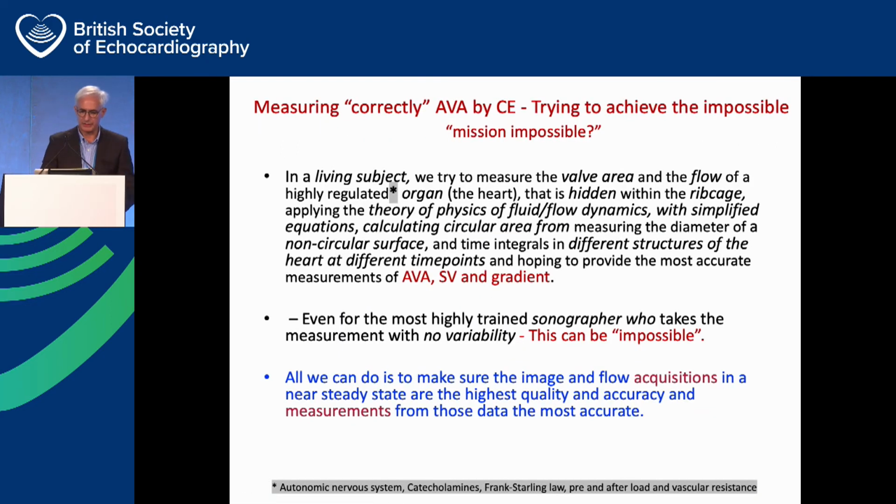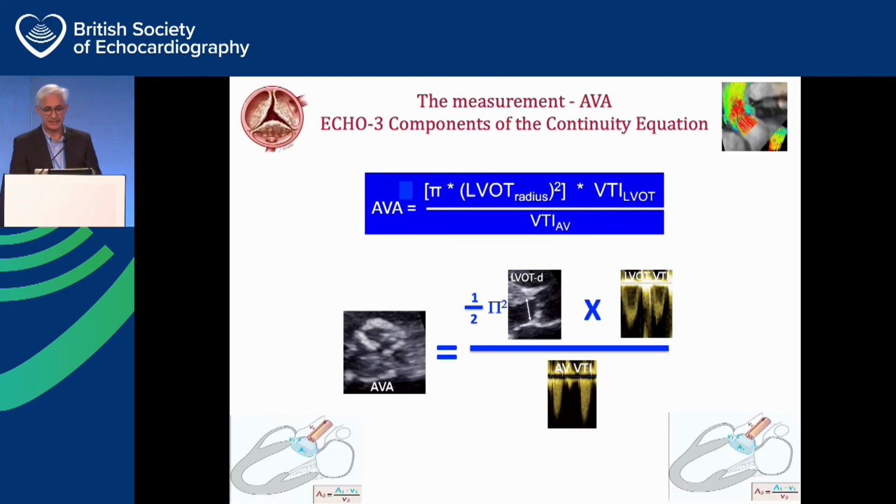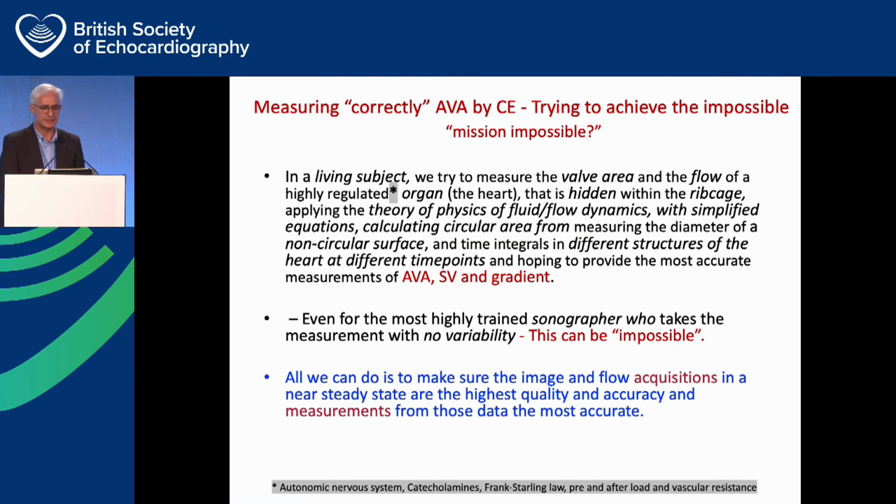I'm going to now, before I do that, spend time to go through this. I'm going to just put you this one, and I do apologize for this philosophical kind of sentiment. I thought I may just put it to us here, because that's exactly what we are facing within the daily practice when we assess our patients with aortic valve stenosis. Can we measure aortic valve area by the continuity equation correctly? Is it possible? Or are we just setting ourselves into a task that is failing by definition?